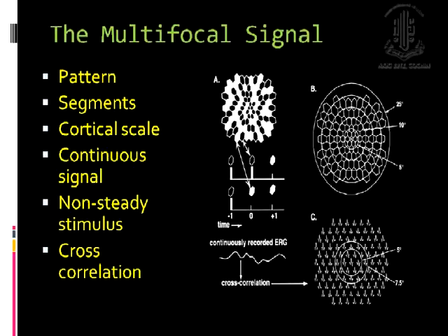This is the pattern that we are having, and this is the sequence that we said. One time this hexagon is off, and the following time it's on, fully luminant, and this contrast creates the response from the retina. You can see here the distribution of these hexagons across different regions and different degrees of the retina. This linear and non-linear mathematical extraction of the signal is transformed onto the retina in something called the cross correlation.